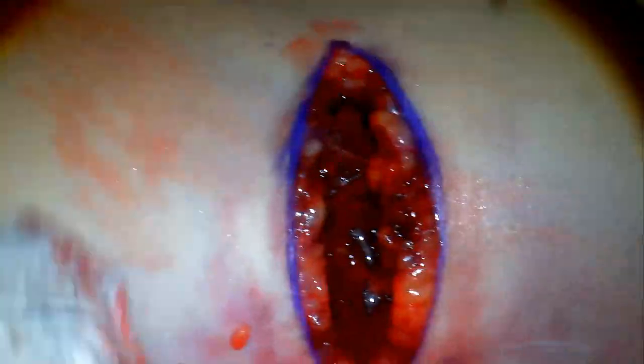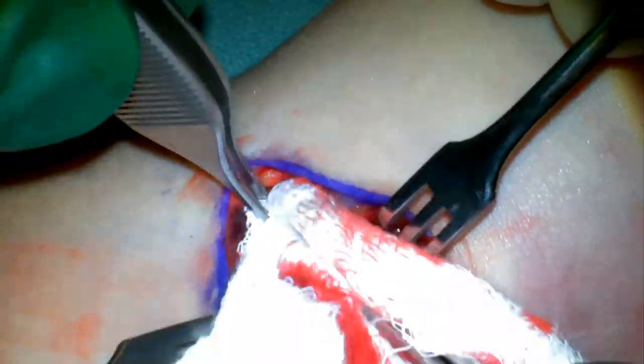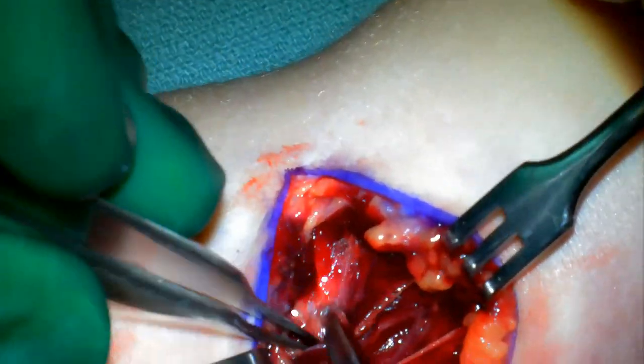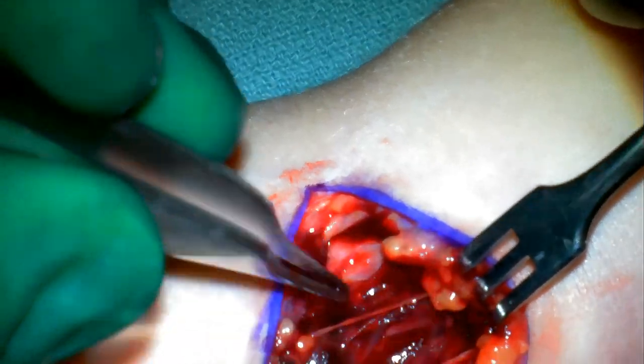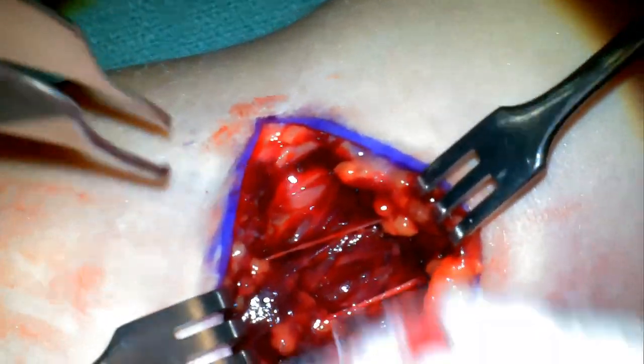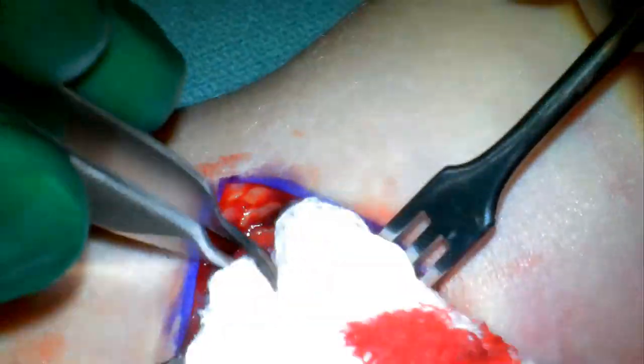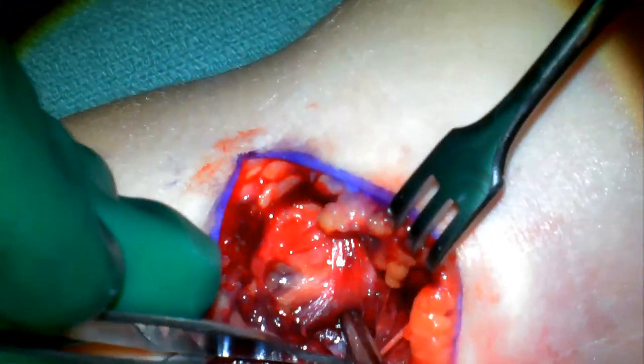Once we get through the subcutaneous fat, we then look for the deeper structures. I'll start laterally to find the biceps tendon, as it's rarely involved in the injury and it's easy to identify. So here it is. The structures from lateral to medial are tendon, artery, and nerve. The artery tends to be a bit deeper here in the middle and it's harder to find, so I'll jump medial and look a little superficial.